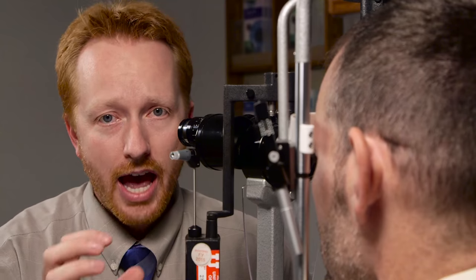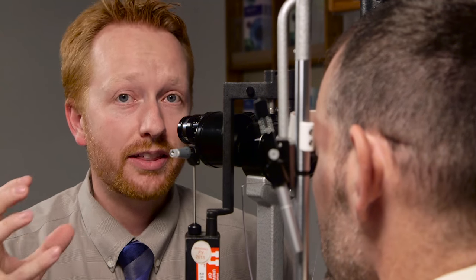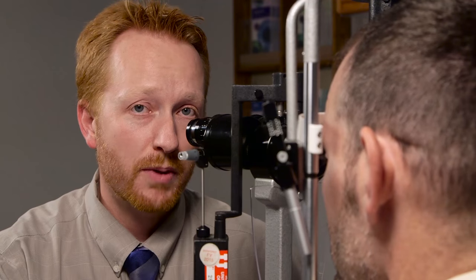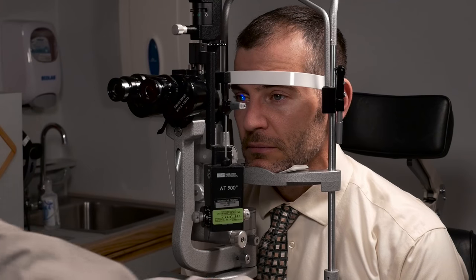Another very important aspect is to look at the edge of the contact lens. The edge should have 0.1 to 0.2 millimeters of fluorescein underneath it. If it's more than that, the patient will probably be very uncomfortable and the lens would probably move too much. If there's not enough, that usually means the contact lens is too tight. In this case, we have an alignment fit, meaning there's very little fluorescein built up underneath the contact lens — and that's an ideal fit.